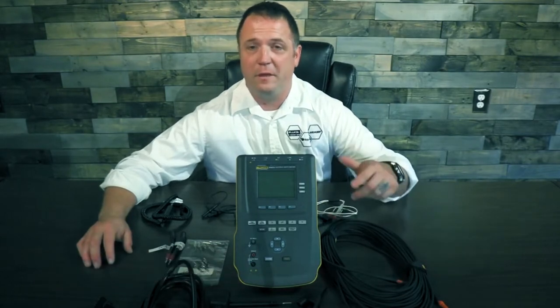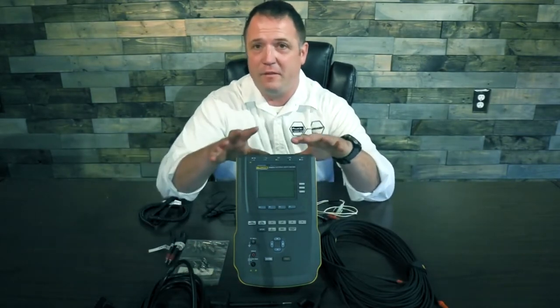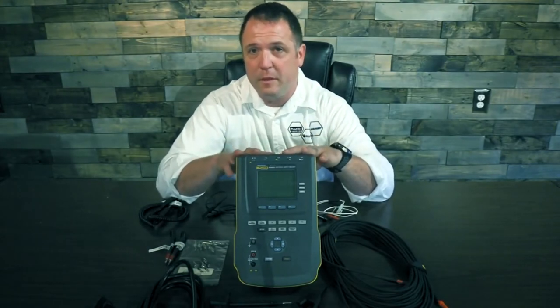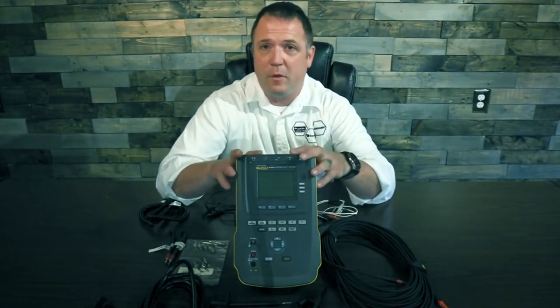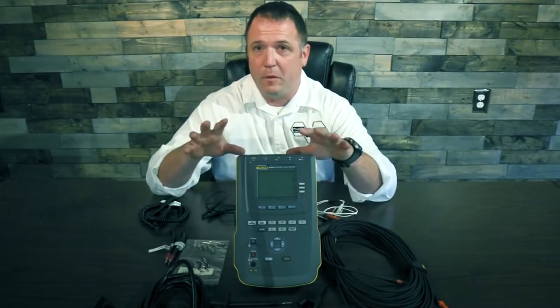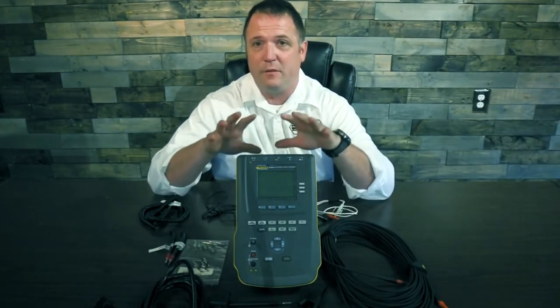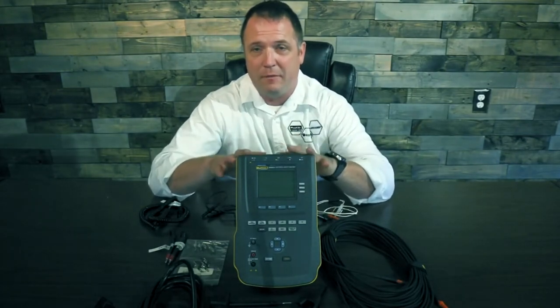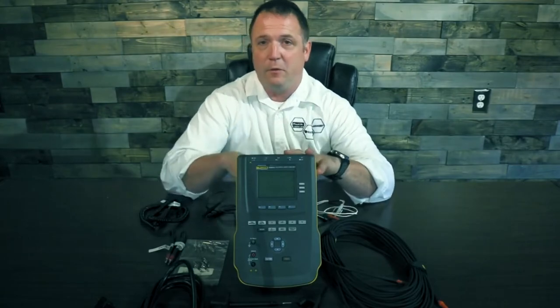Hello, everybody. I'm Justin Ross with Fluke Biomedical. Today I'm going to go over some of the accessories for our ESA line, specifically the 612, 14, and 15. Today I have an ESA 614 here — this is a product you only see in the U.S. market. If you're outside of the United States, you'll probably be familiar with our 612 or 615. A lot of people don't realize just how many accessories we have for this device and how much easier they can make your life.